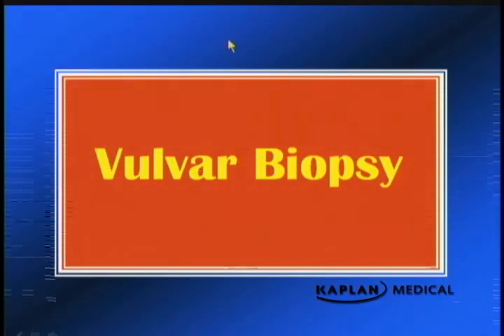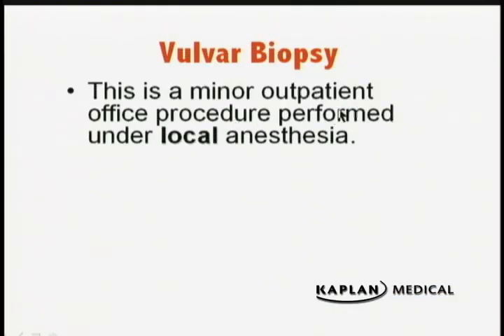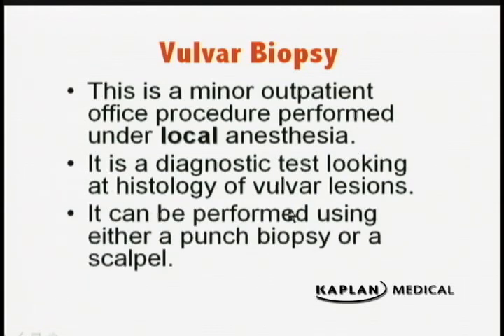Vulvar biopsy. This is a minor outpatient office procedure performed under local anesthesia. It is a diagnostic test looking at the histology of vulvar lesions, and any vulvar lesion of uncertain identity should be biopsied. You can either use a punch biopsy or a scalpel.